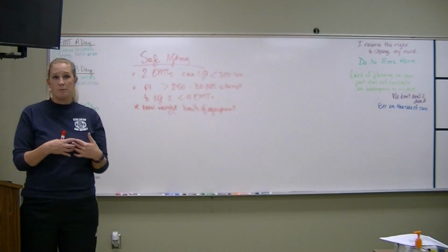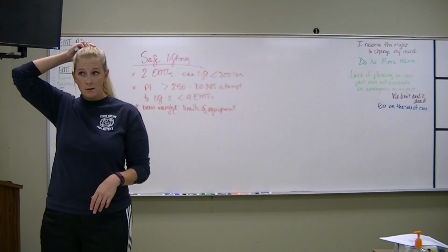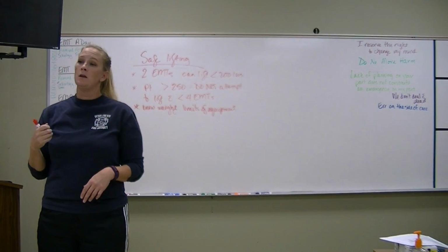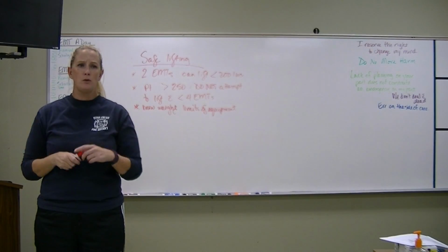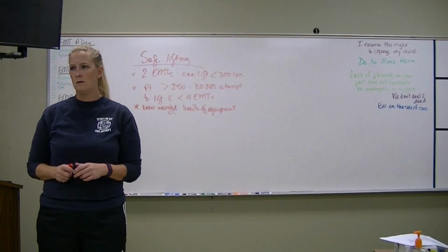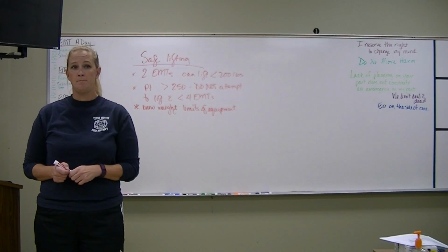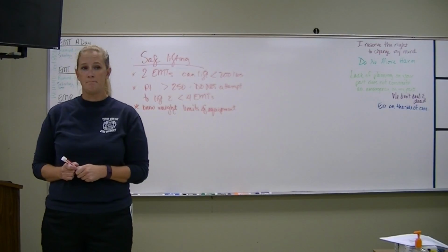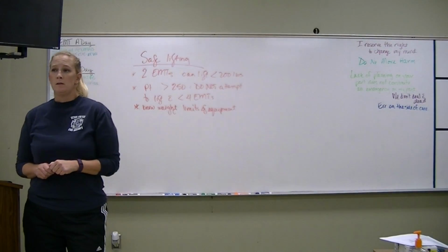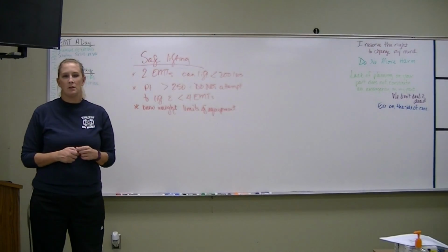Luckily, we're in a classroom. We have time to educate ourselves on the equipment. We're not in the field where we don't know what's going on. How often do you guys go to your EMS transport agency and spend time playing with their stretcher? Never. Not yet. They came out once. Yeah, they've come out a couple times, but it might be something you want to talk to them about when your working relationship is a little better.